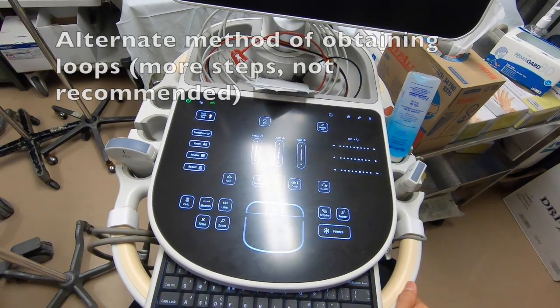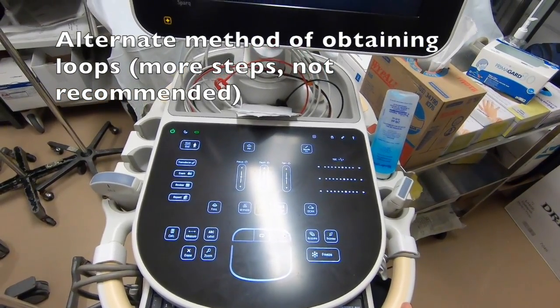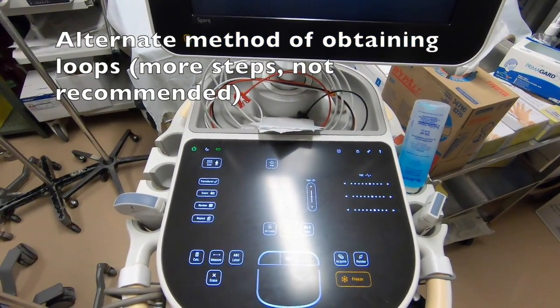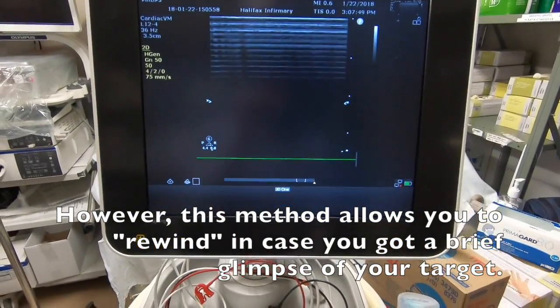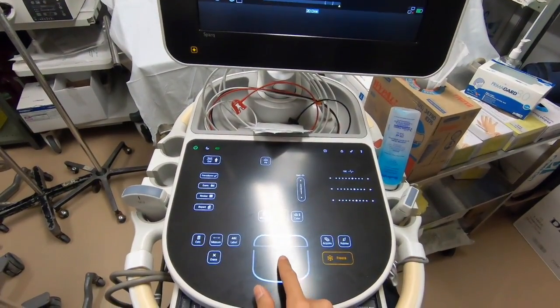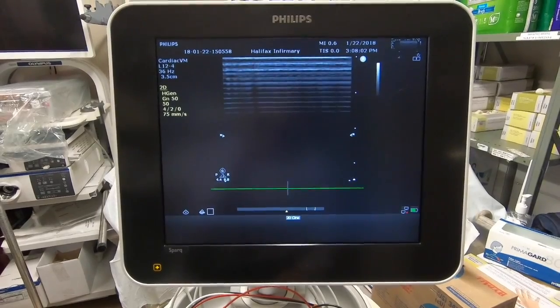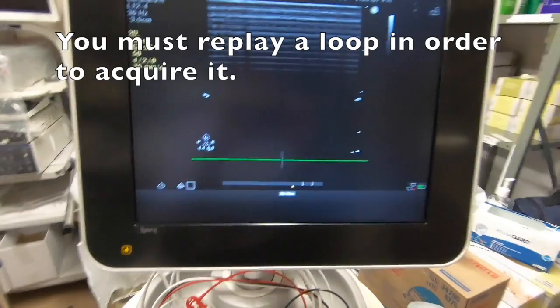The second way of acquiring a live loop is to position a probe on the patient, and once you have obtained a loop that you would like to keep, press Freeze. When you press Freeze, it records the past couple seconds of footage. You have two options of reviewing this. If you slide your finger to the left and the right, you can scroll through the images frame by frame. However, if you would like to replay the loop, you may do so by using the on-screen touch panel.